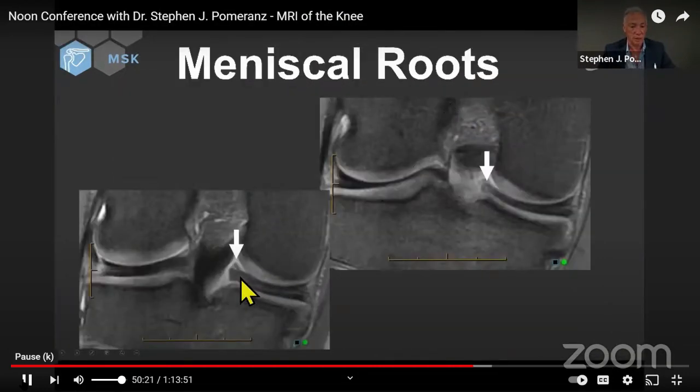You saw this slide earlier, chop, chop. We chopped off the attachment of the meniscus to the tibia. Now, here's another little pearl. We had that LaPrade classification, and it talked about different kinds of tears and avulsions, but what it didn't talk about was the ligaments. This is not a meniscus tear.